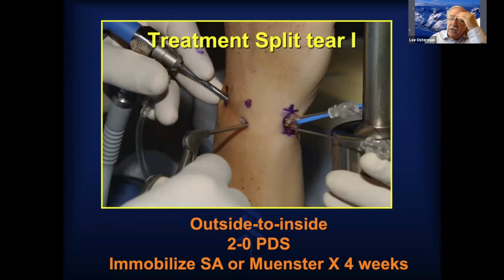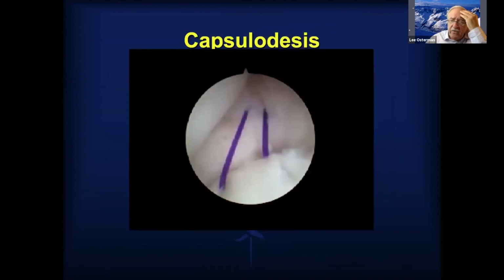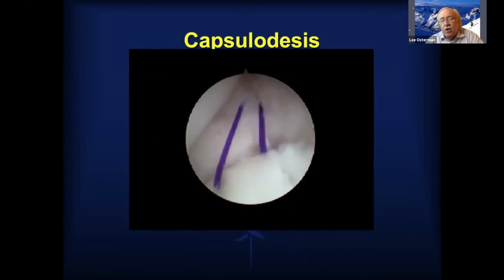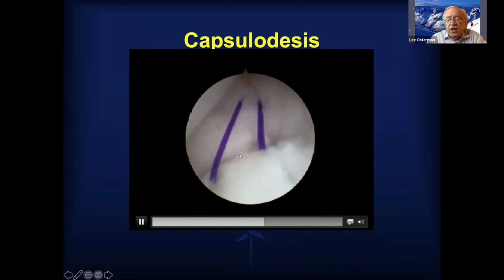The treatment, for me, is an arthroscopic assisted repair, if you will, a small incision made volarly in that area. Watch the dorsal ulnar sensory nerve, and then an out to in repair, a short arm splint. We seldom use a Munster. And the repair looks like this: several stitches placed across the ulnar extrinsic tear, which is seen along this area, and the immobilization.